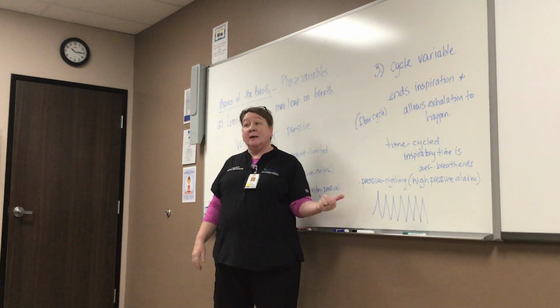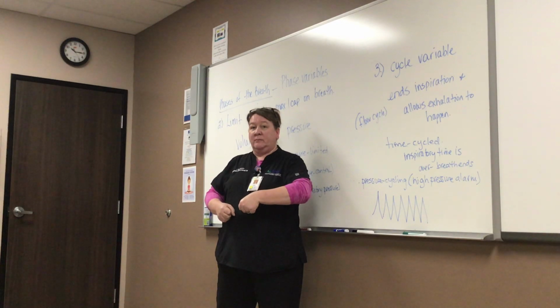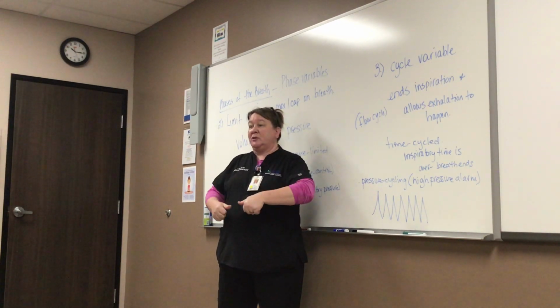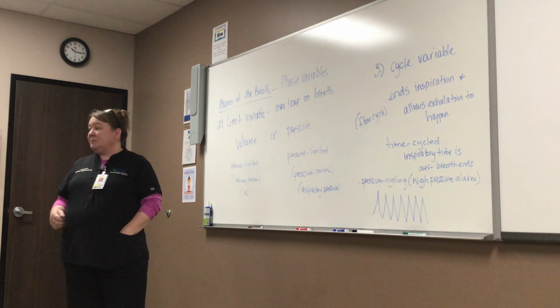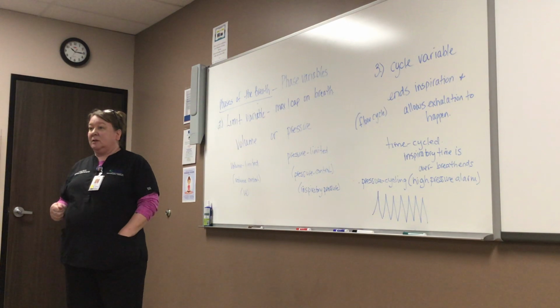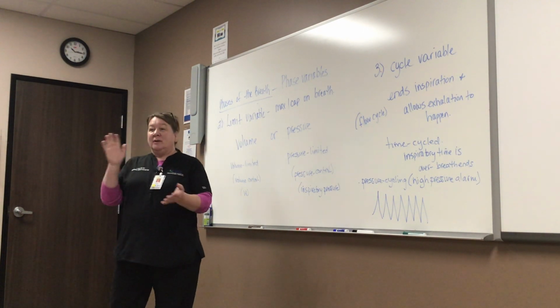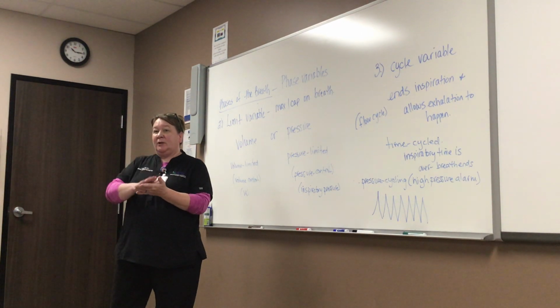If you bag them and you can't, you're bagging your patient and you can't do anything, what do you do? Okay, what do you do first? Try to pass a suction catheter. Can't pass a suction catheter, what do? You're taking your boards, what do? You're extubating. We never put saline down the tube if you're taking the test. Remember. So, pressure alarm's going off like crazy. Take your patient off and bag them. You can't bag them. What do?